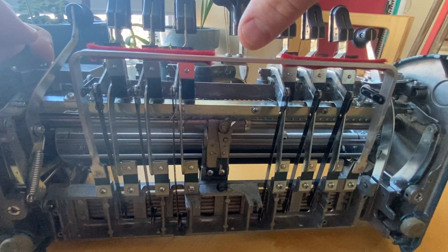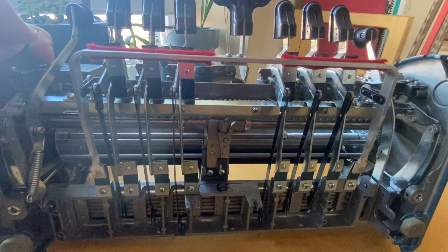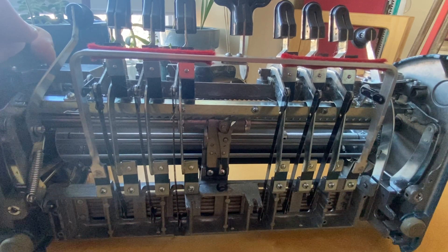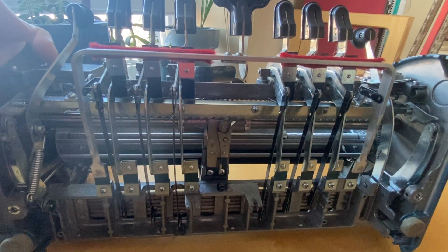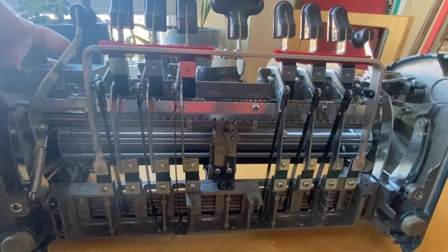So I push down on the space key, it lifts up the rack bar, which allows the cam lever on the embossing head assembly to move forward just one unit, and then it is caught by the tooth of the rack bar, and it moves forward.